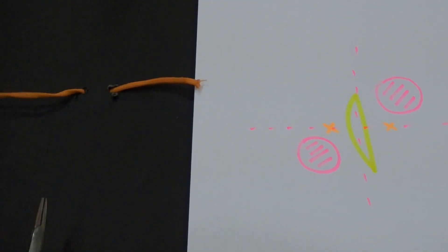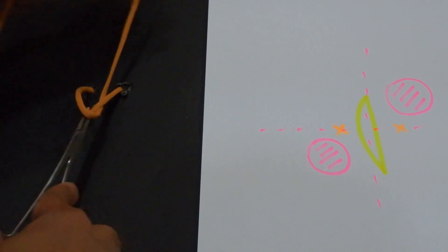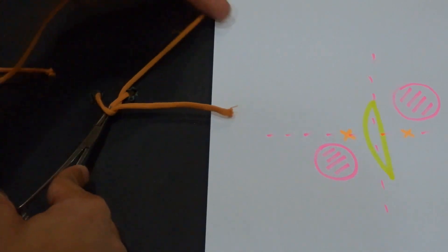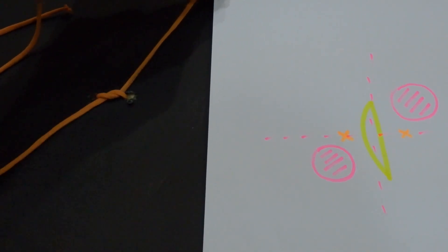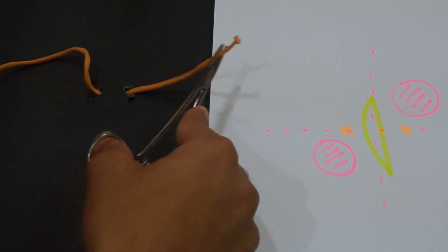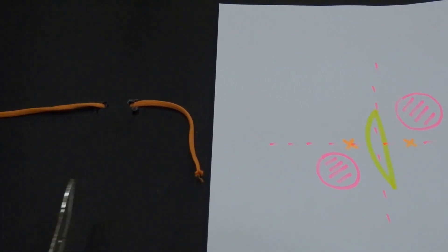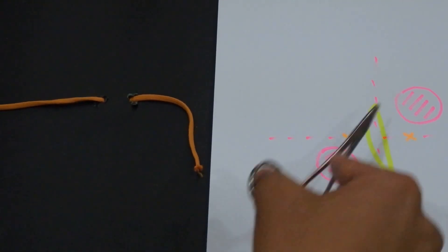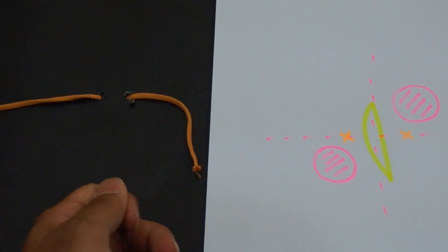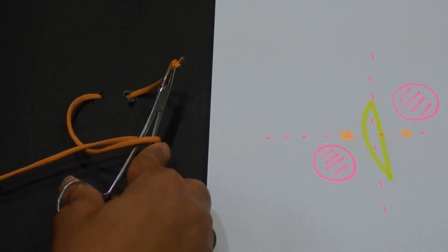The third principle is to make it short and hold at the tip to make it easy, because if we make it long and hold the base it will be difficult and we will struggle. So these are the three principles for tying using the needle holder: first, changing the direction toward these corners to make it a square knot; second, never crossing your hands; and third, making it short and holding at the tip.